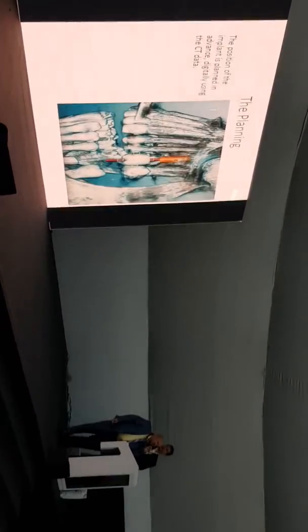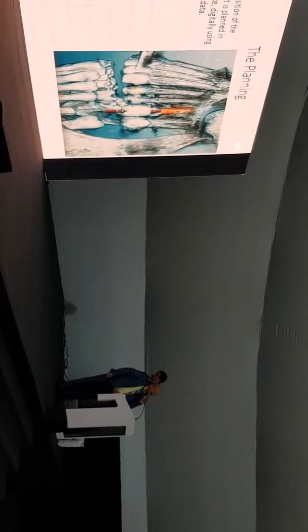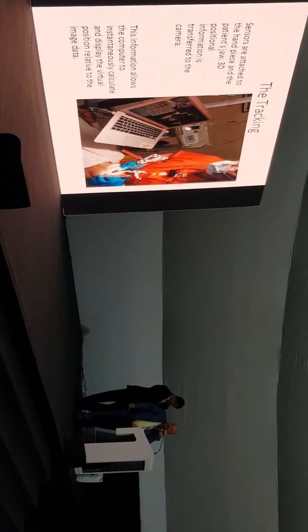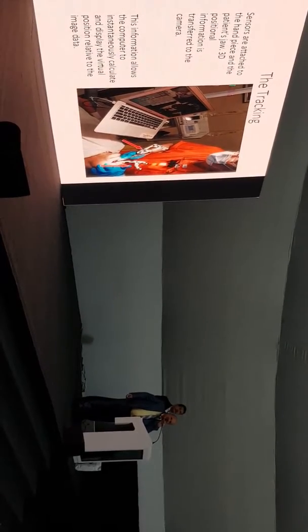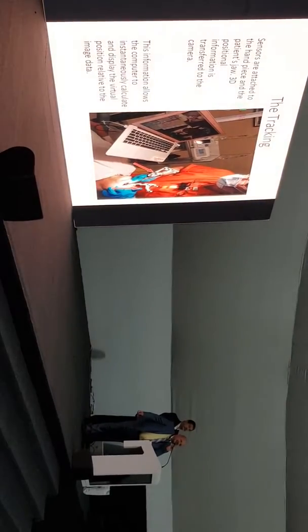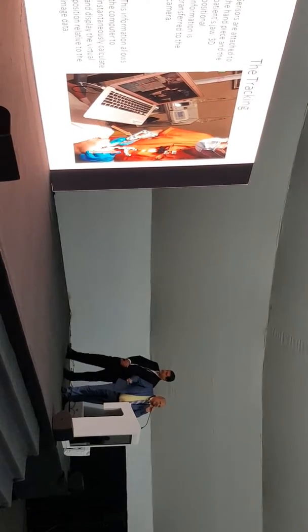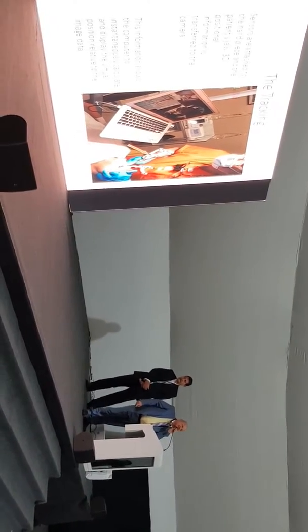First of all, we start by making a plan. We plan our implant, combining the best place for our prosthesis or the things we need. After planning the implant, those we are showing are the tracking sensors. I mentioned them before. This sensor in the hand of the dentist is connected, as I said. We will explain all those details later. Now it's a small briefing as an introduction to the system. And in the mouth of the patient, it is a stand.